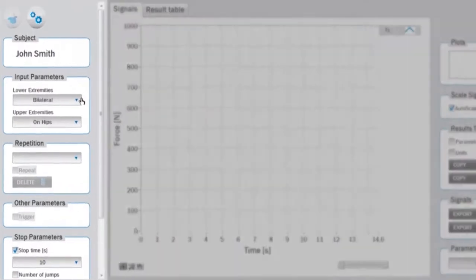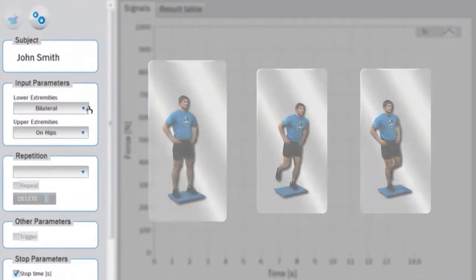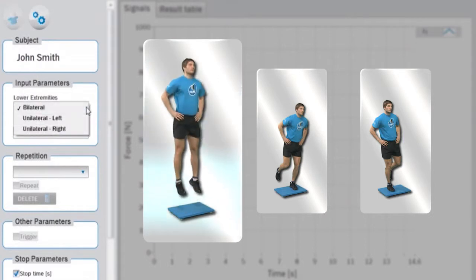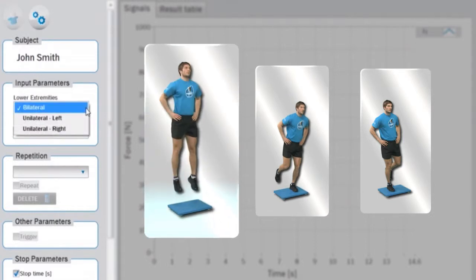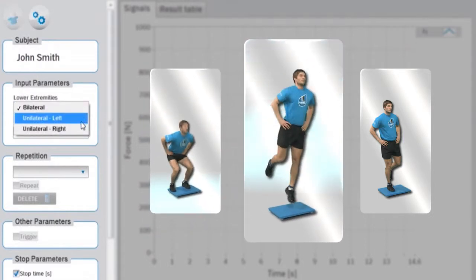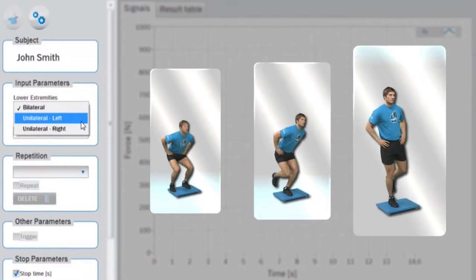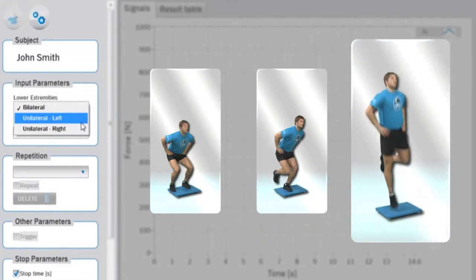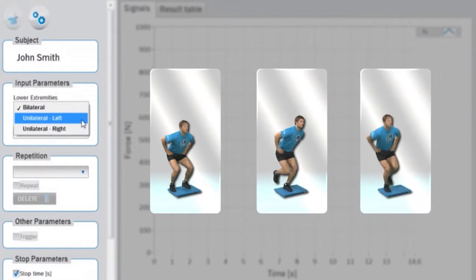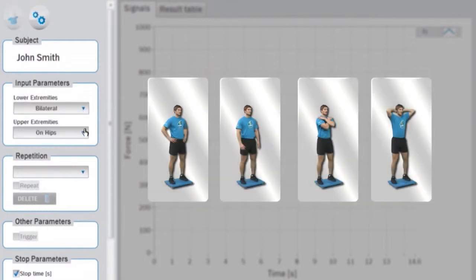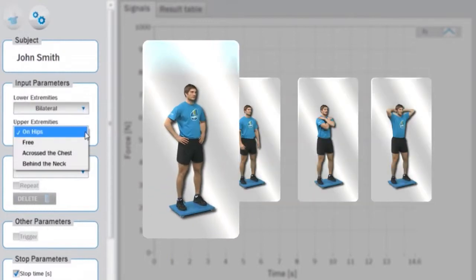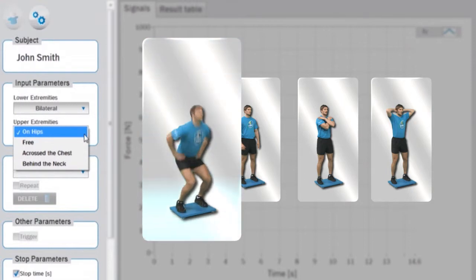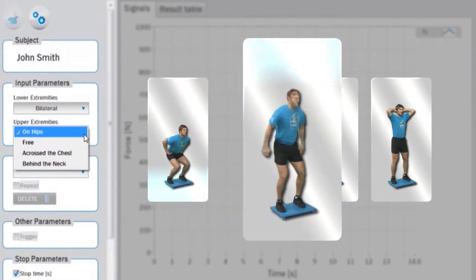For lower extremities, you can choose among bilateral jump, jump with the left leg, or jump with the right leg. For upper extremities, you can choose among hands positioned on the hips, freely positioned, crossed over the chest, or positioned behind the neck.